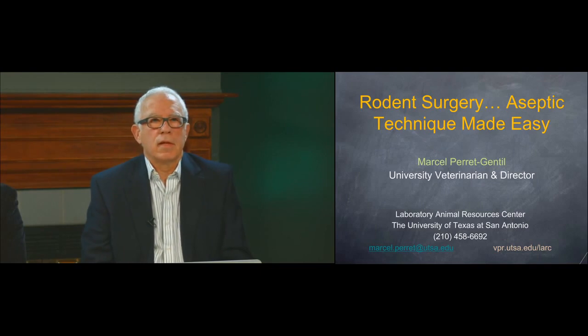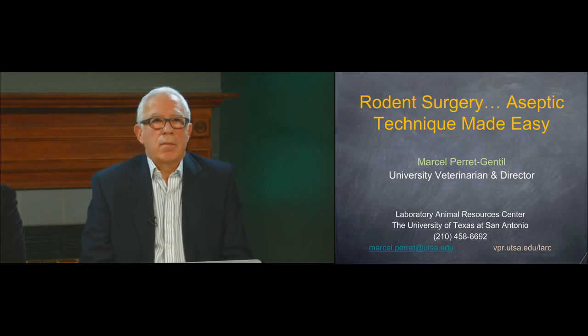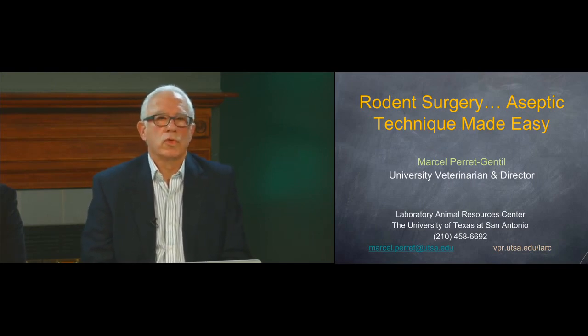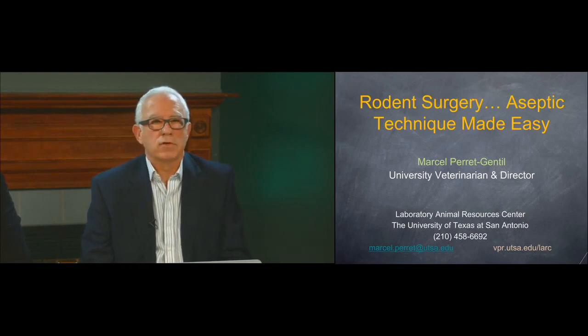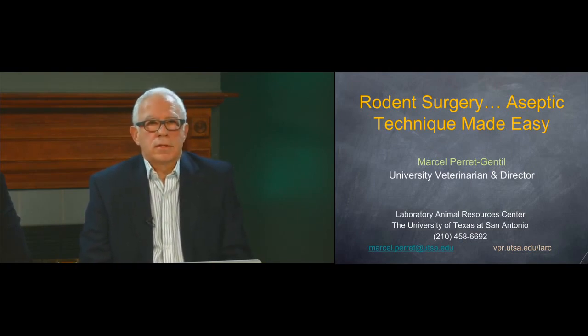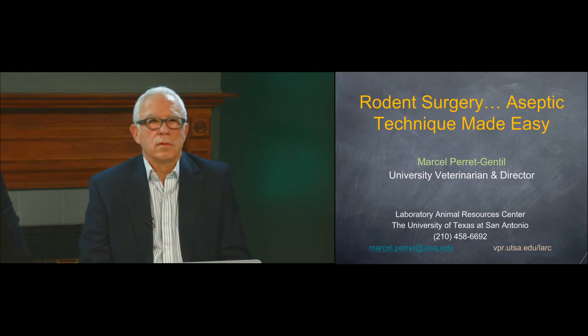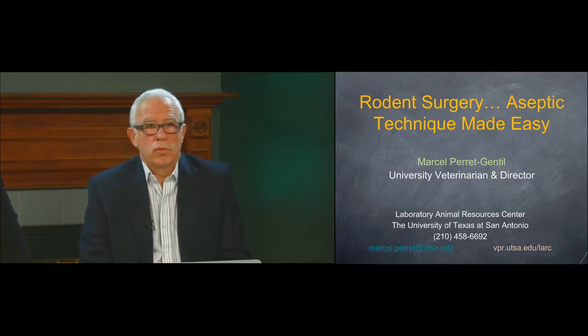I see that the investigator has autoclaved the instruments, but when they place the instruments on the table, they put them on non-sterile surfaces. So right there we have cross-contamination. There is no surgical drape, no sterile gloves. There are no sterile gloves to be found anywhere in the investigator's lab. There is all kinds of cross-contamination. The individual doing the surgeries kept adjusting her glasses and the mask on her face and this and that and the other. So I say, I think we have a real problem.